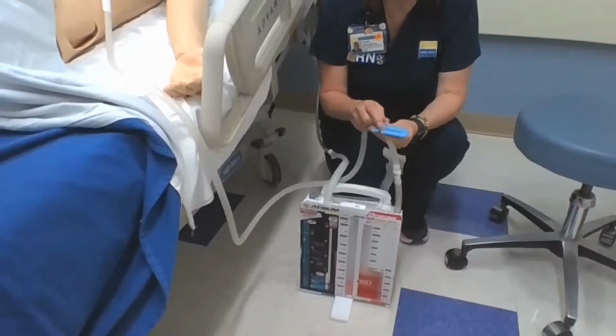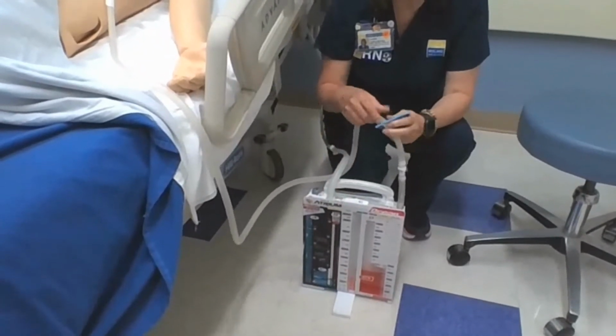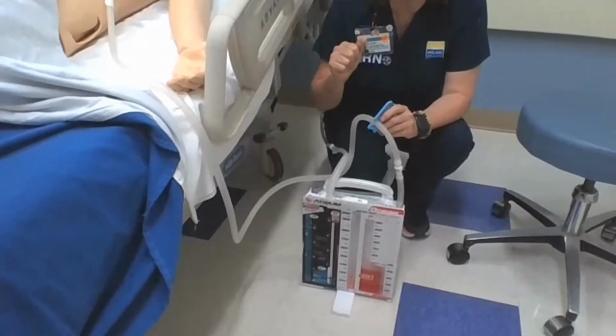We never clamp a chest tube unless we A, have a doctor's order, or B, we're changing out this Atrium. But I need to know that the clamp is there, because if something happens to this tube, I need to be able to clamp it in an emergency so that a bunch of air doesn't go rushing into my patient.